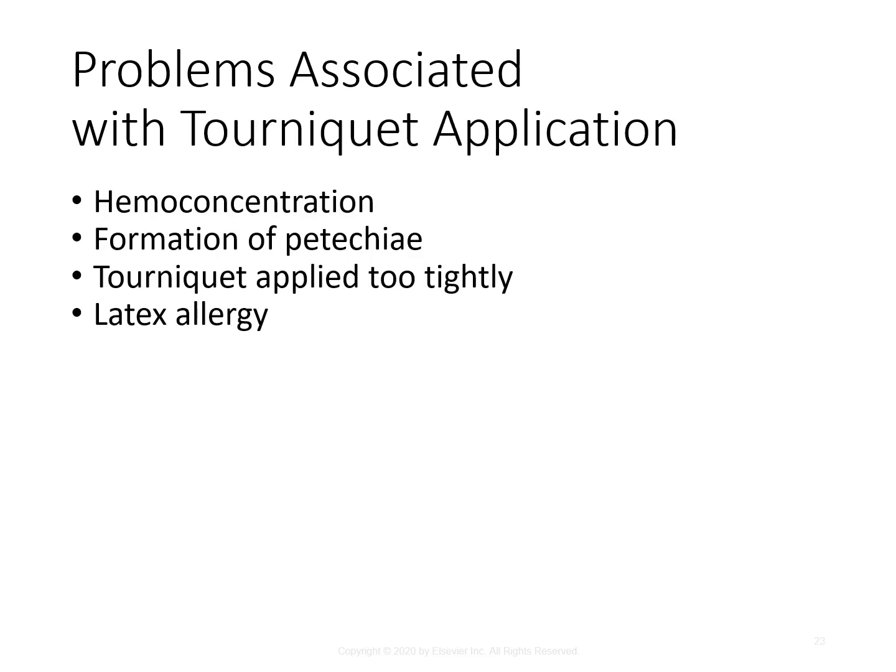Problems associated with the tourniquet application. If a tourniquet remains in place too long, the plasma portion of the blood can filter into the tissue, which can cause an increase in the proportion of cells remaining in the vein. Prolonged tourniquet application can also alter potassium and lactic acid levels by a different mechanism. So it can cause hemoconcentration.